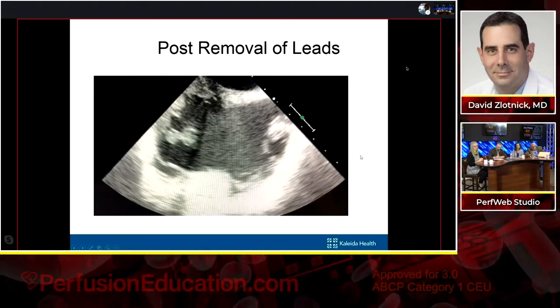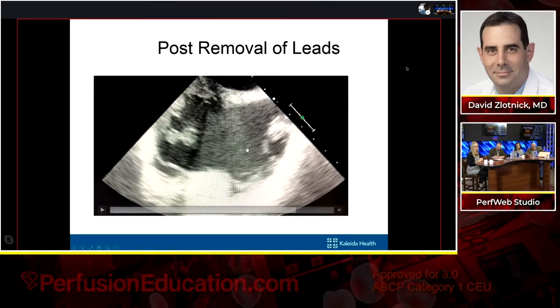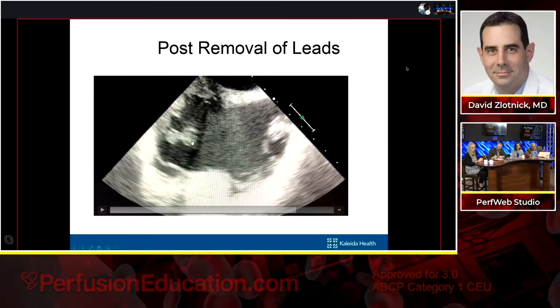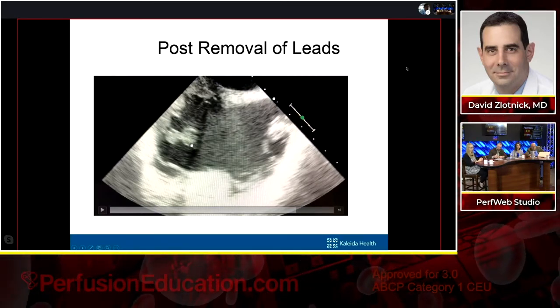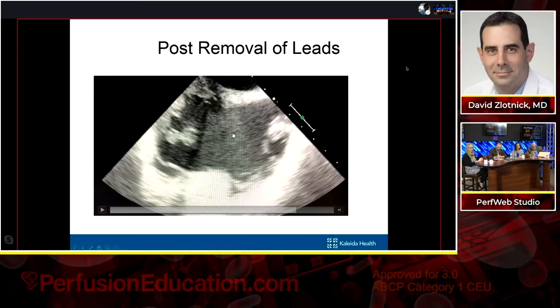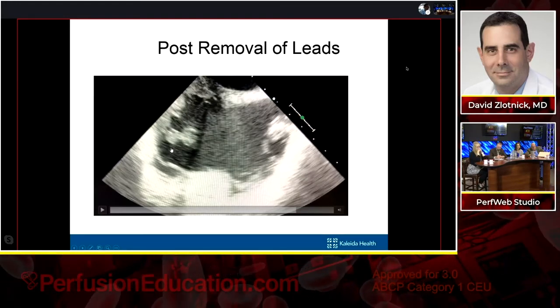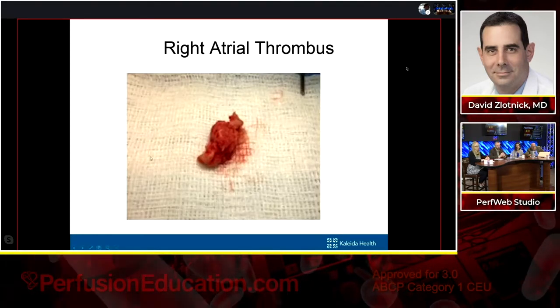And so we went back in with the AngioVac. I was able to get it up against the tip of the AngioVac, and then I used a snare, put the snare over it, cinched down, took it off the wall, and then externalized it out. And that's what it looked like after we got that out.